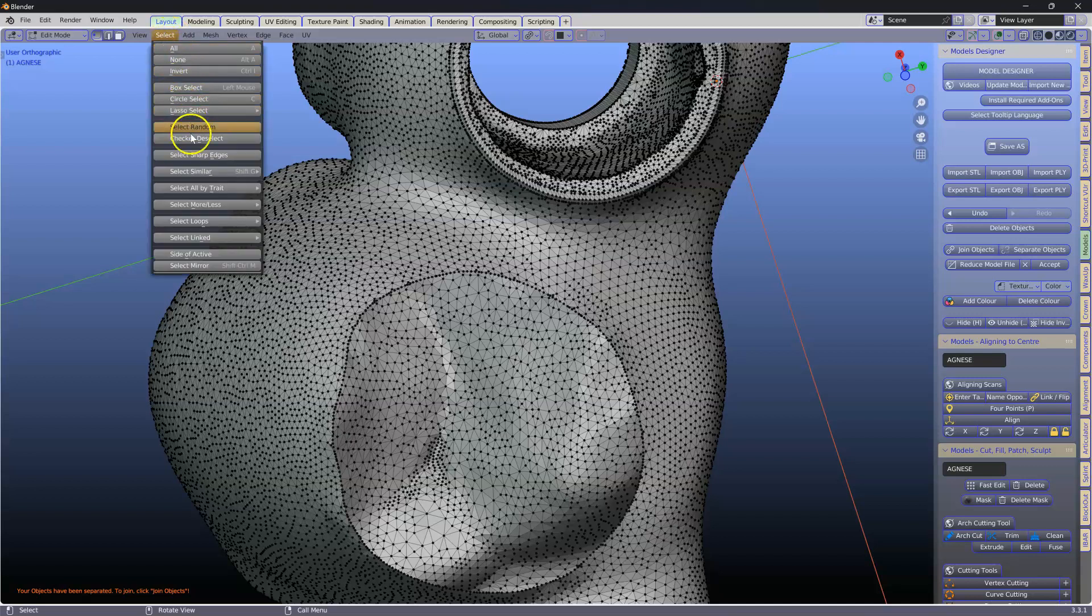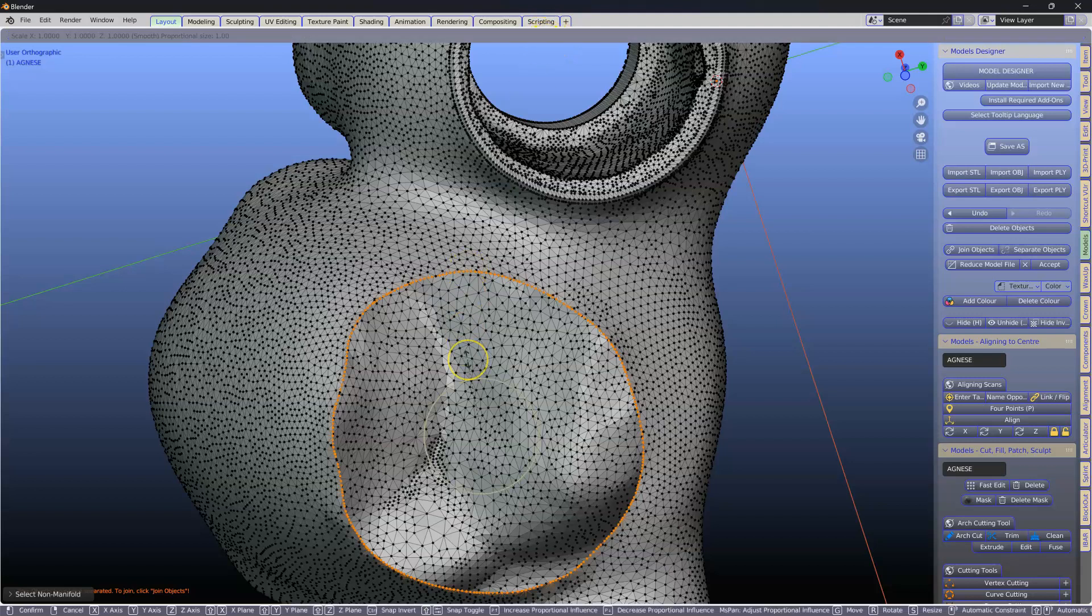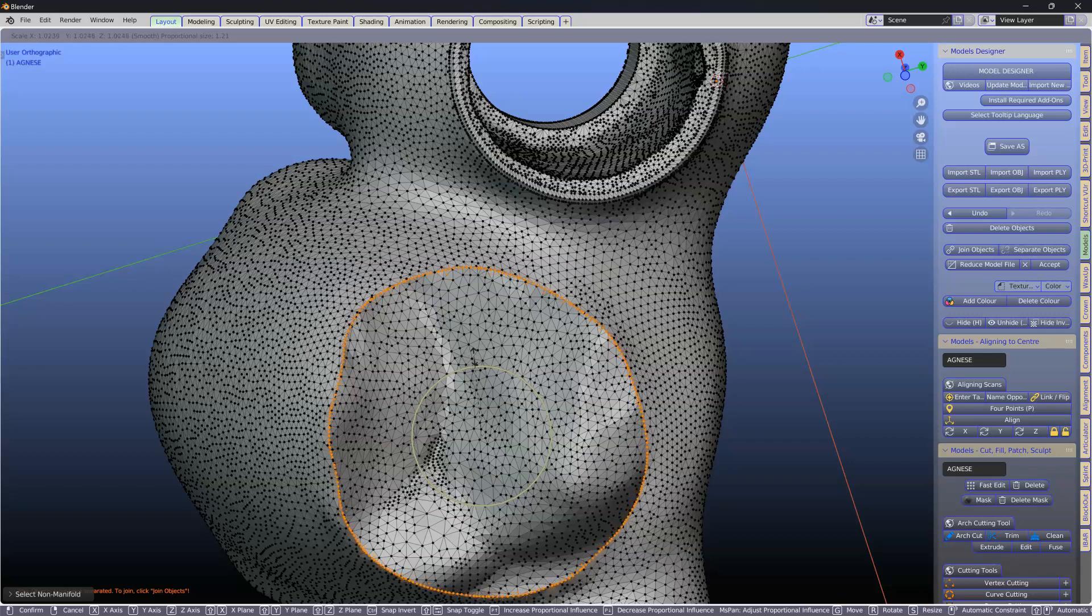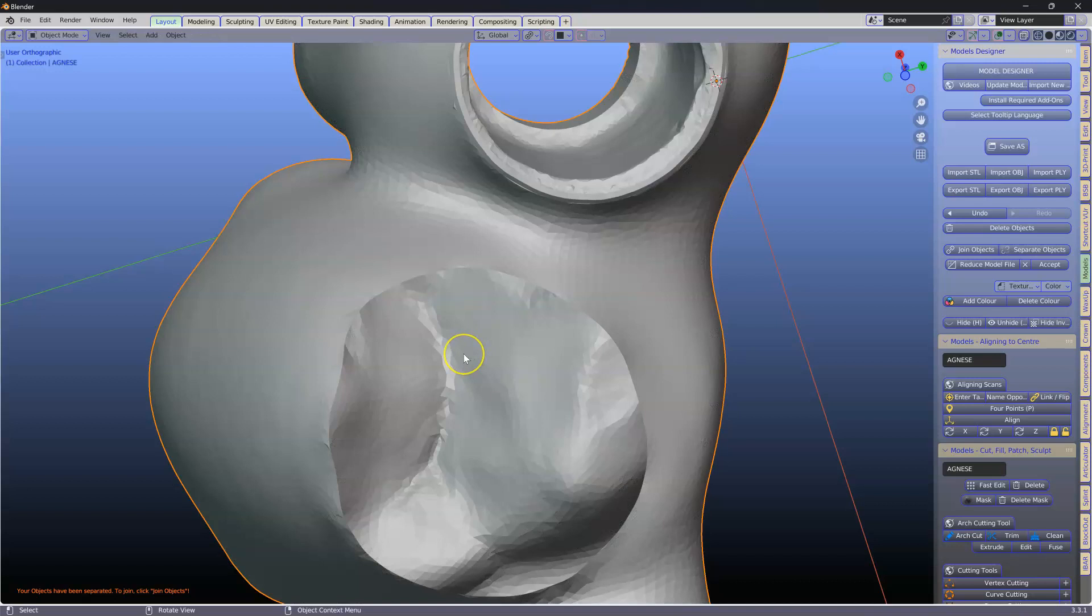Select all by trait, non-manifold. Proportional editing on, magnet is off. S to scale, and we're going to move your mouse just a little bit like that. Alt A. Tab to get out of it.